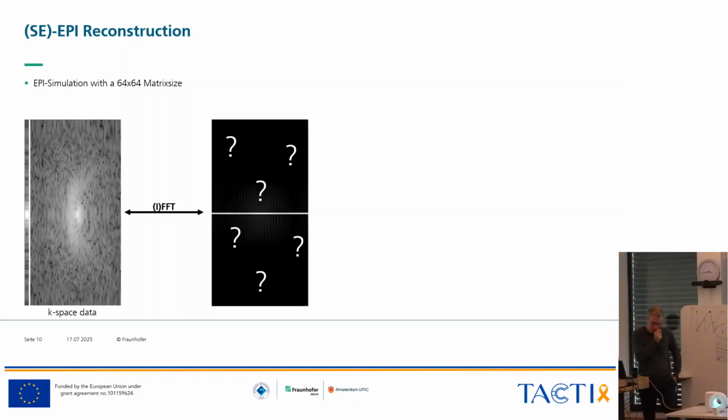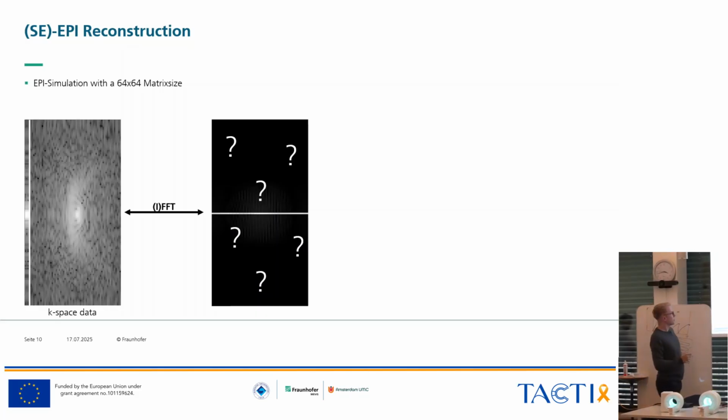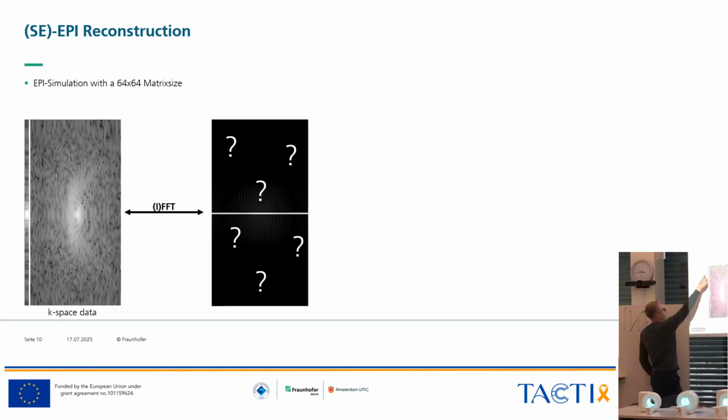But what you see there is exactly what Daniel explained. So we have 3 lines of k-space up front of the acquisition. This is your reference data, so you acquire the central k-space lines. This is why you always have a quite intense signal in the central part. So you acquire the central data line, like up, down, up.